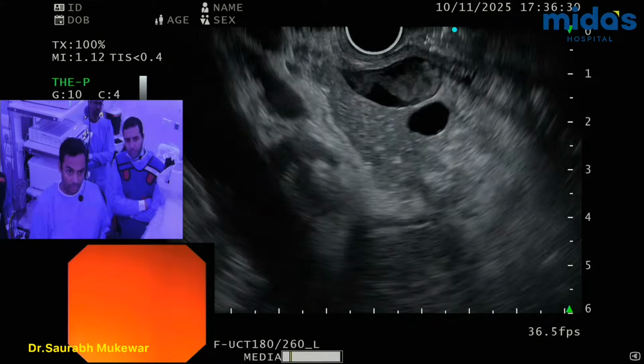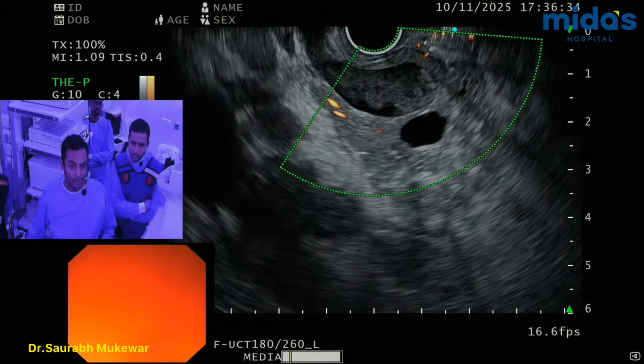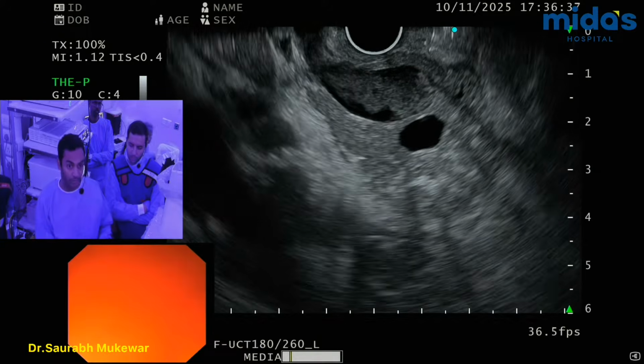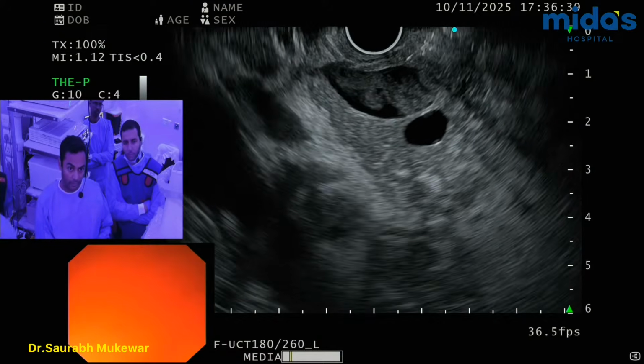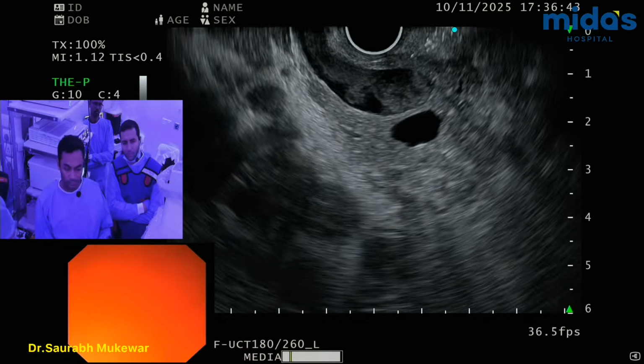And I'm going to first puncture, and maybe, I don't like to put contrast, but I may want to do it in this case just to get an idea about the duct. Okay. Yeah, this is fine. Spot. Brilliant.